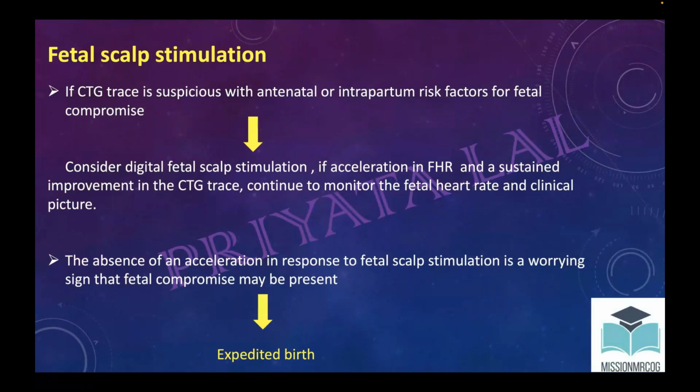So this is all about fetal scalp stimulation. According to this guideline, we do fetal scalp stimulation in suspicious CTG with risk factors. Do this stimulation and look for acceleration. If acceleration is there, be happy, monitor the labor. If it is not there, the baby is not doing well, compromise is there, please do expedition of birth.